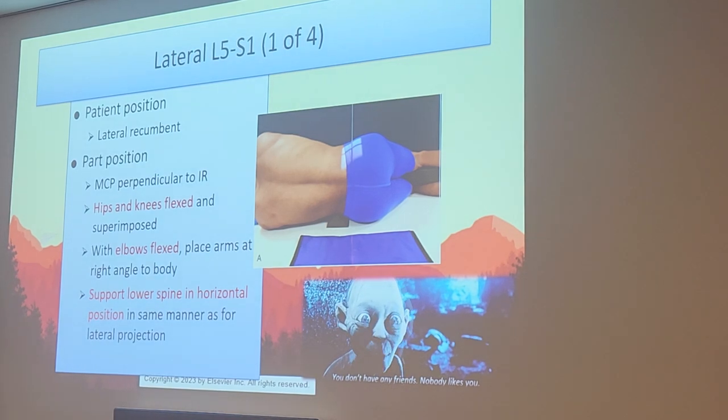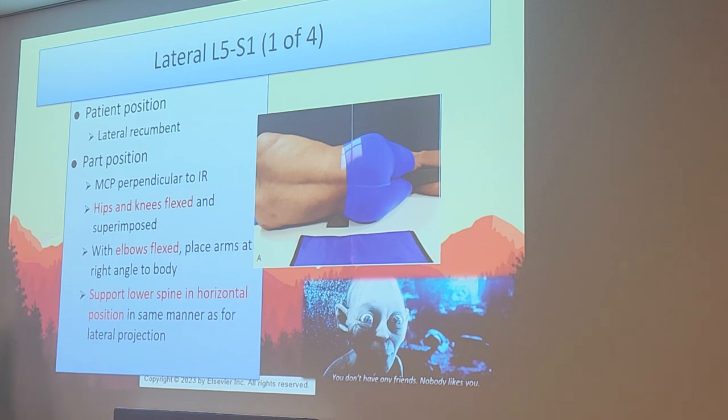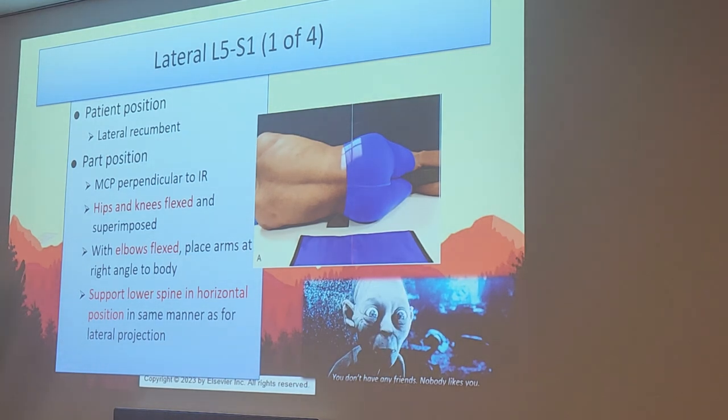So same thing, guys. Hips and knees flexed on top of each other. We want to make sure it's a nice, true lateral. Hips are in the same plane, shoulders are in the same plane. If there's any curvature at all of the body, it's going to close that joint space off. Elbows flexed, raised up, with arms up out of the way. And like I said, you want to support that lower spine, if you have it, with a sponge to get that nice straight line. But that's also what your little angulation is going to help mitigate when we add that angle. I'm going to show you what I'm talking about here in a second.